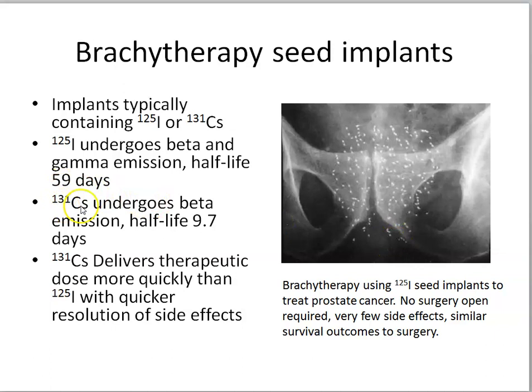We can also use cesium-131. That has a much shorter half-life, so you deliver the dose in a very short period of time with this one.